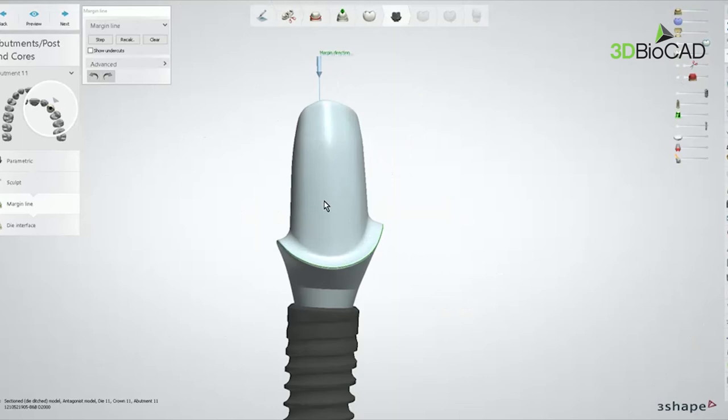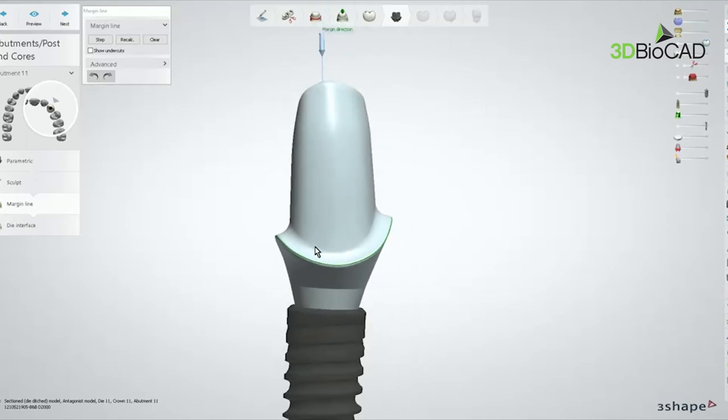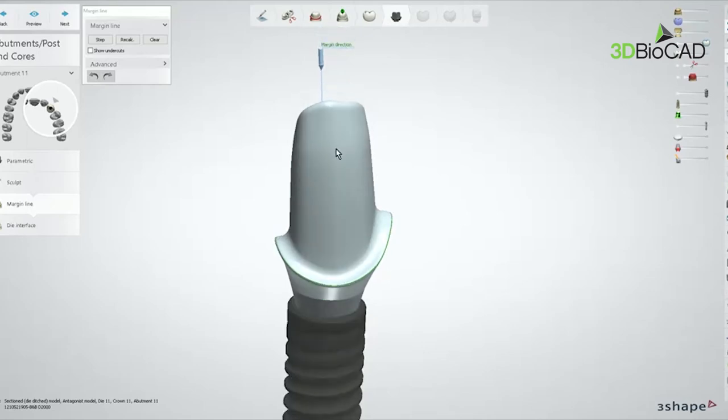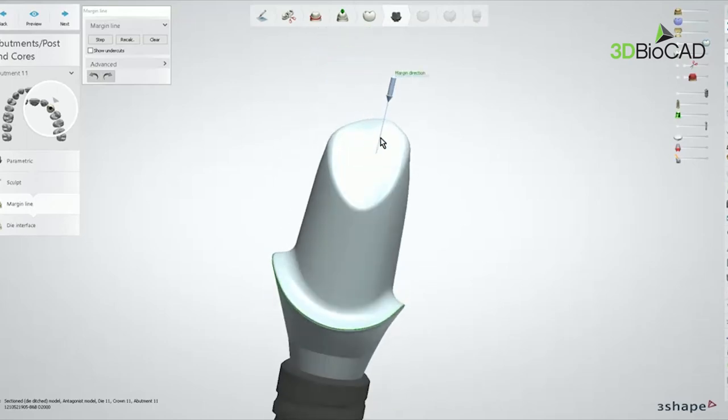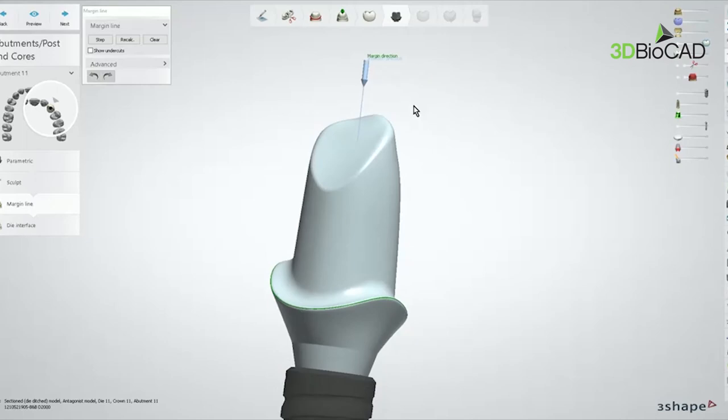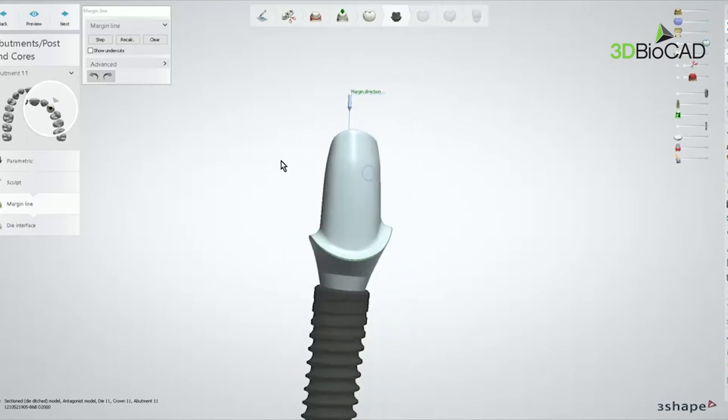The first thing, if my abutment design is not really perfect, we have to modify it a little bit and the crown does not fit. Second thing, we mill the titanium correctly, we mill the zirconia correctly, but they just don't fit well. Number three, sometimes the margin is too short, sometimes the margin is too long, and we don't like it. And number four, the crown just does not fit well. Maybe it hits the bottom, the top of the abutment area or inside of the crown, titanium and zirconia hitting each other. We have some issues with that. So for my provisional cases with titanium and PMMA, I go 100% this way.